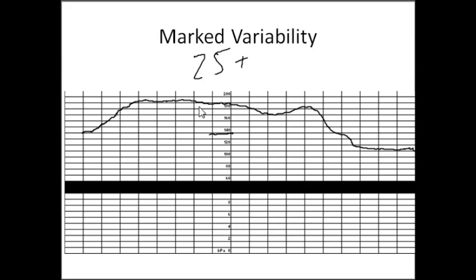Now, I can't really show this over such a short period of time, but the baseline, so maybe that's continued over, the baseline is changing pretty significantly. Now, this is not an acceleration because it's happening over a period of 15 seconds or 15 minutes or so. So that wouldn't technically be an acceleration. This would be baseline variability.